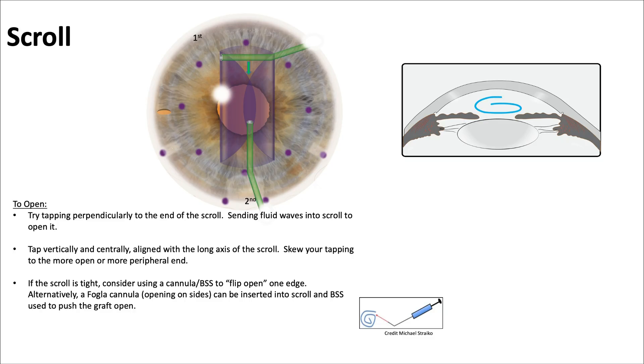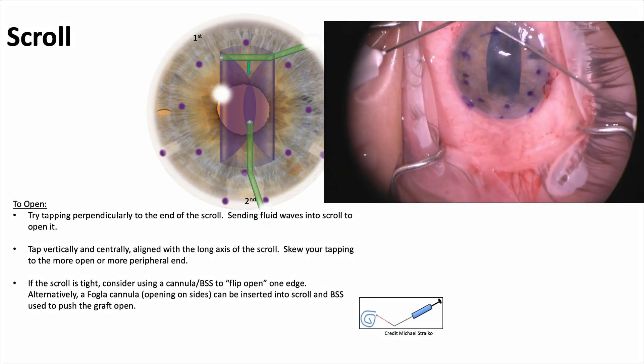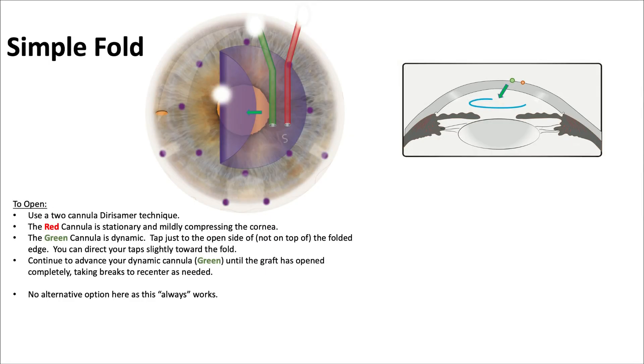For the scroll, tap perpendicular to the end of the scroll to send a fluid wave down it to open it. You can tap centrally, vertically aligned with the long axis, skewing the tapping to one end or the other. If it's tight, a fogla cannula can be used to inject BSS. Light tapping sends fluid waves down the middle to open the scroll.